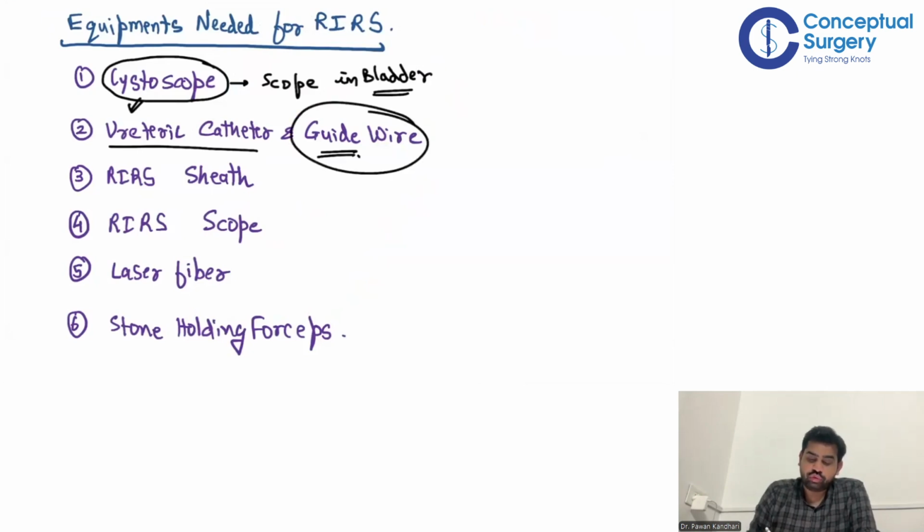So when I was a surgical resident, we did not have a full-blown urological department, but occasionally the urologist used to come to the hospital and operate a couple of cases. And as a first year, they always used to ask for something called a Terumo guide wire.